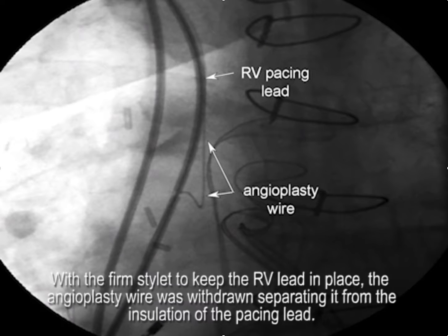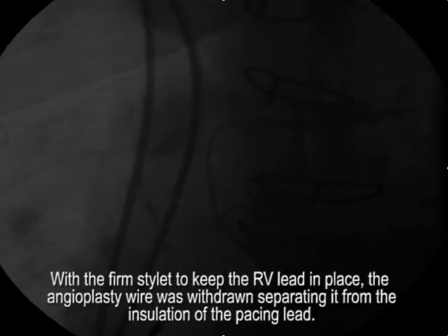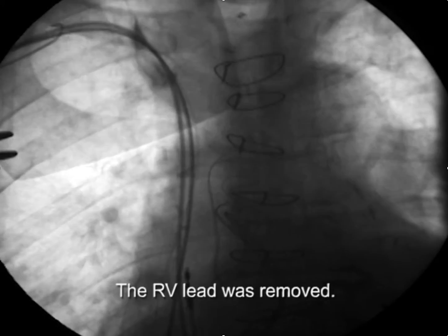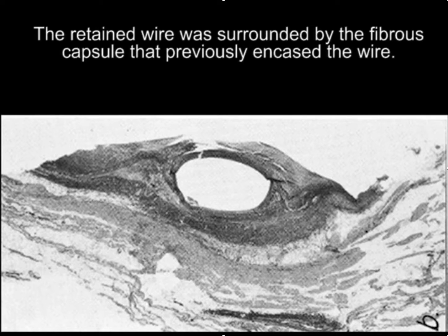With a firm stylet in place to keep the lead from pulling back, we tug on the angioplasty wire to separate it from the insulation. Once it's free, you advance the wire as far as possible down the inferior vena cava, then withdraw the RV pacing lead. At this point, we now have an angioplasty wire inside the fibrous binding capsule that had previously encased the lead.